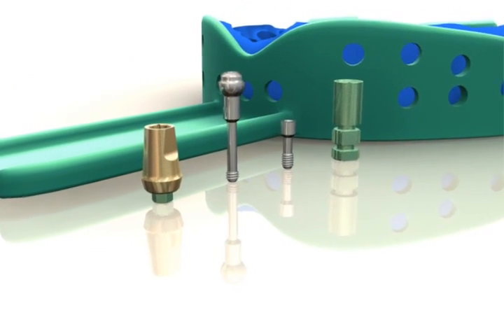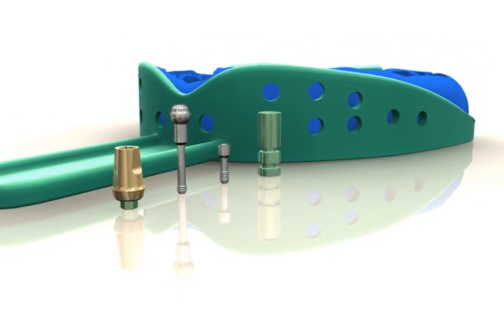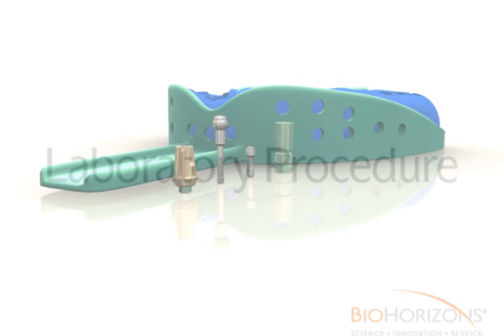Send the abutment, ball top screw, abutment screw, analog, and impression, as well as a bite registration, shade, and opposing model to the dental laboratory.